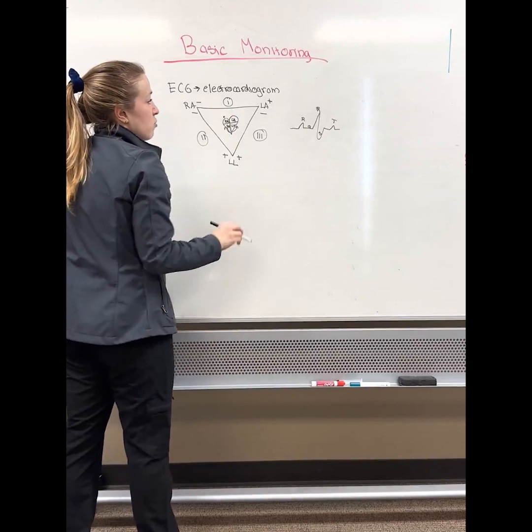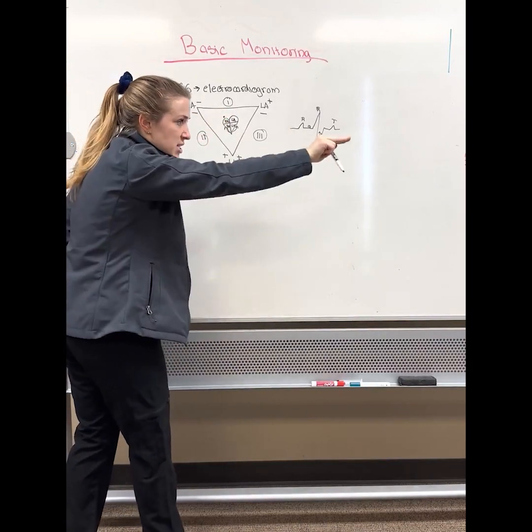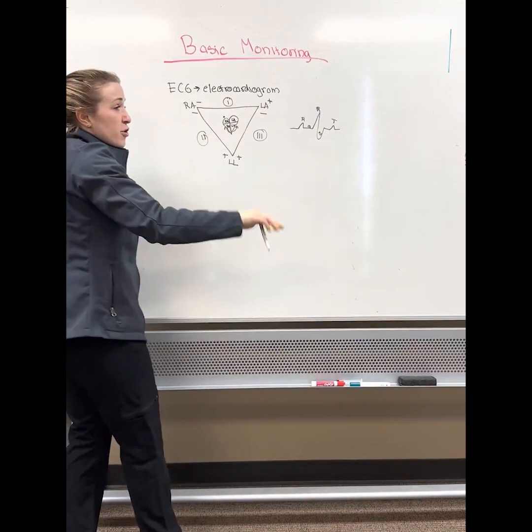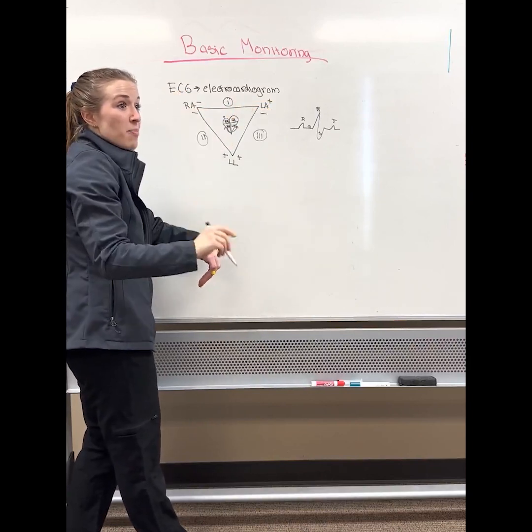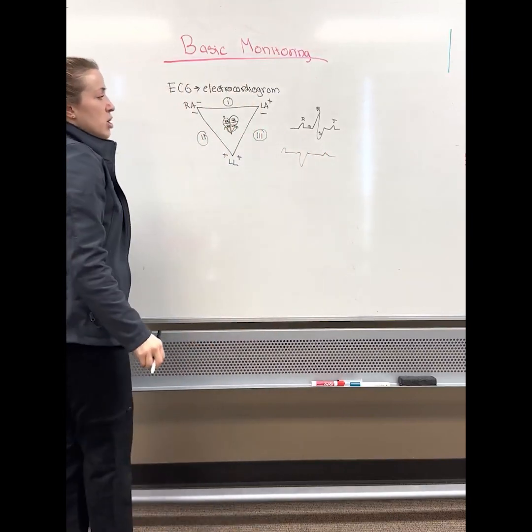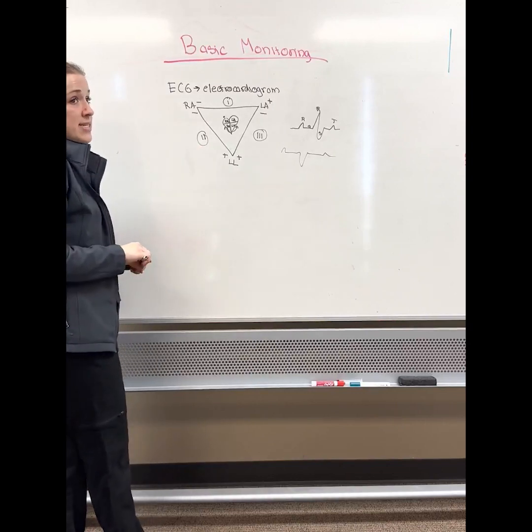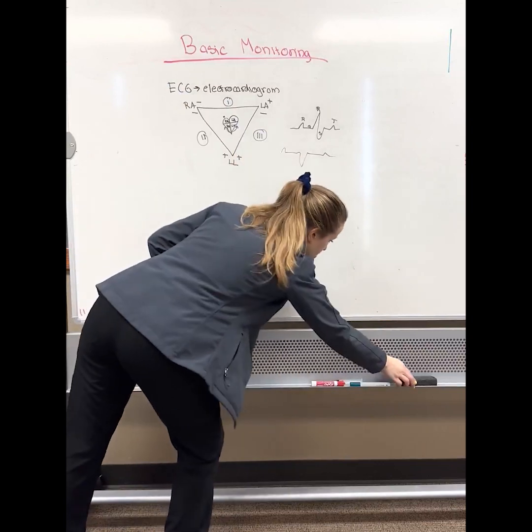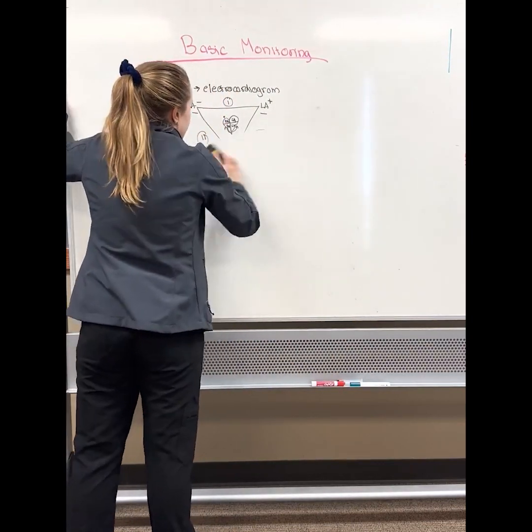Now, if you select lead 1, you're going to look at the electrical activity kind of across this way instead of down. So if you're reading this way and the heart depolarizes this way, is the QRST going to go up? No, it will not. It usually ends up being inverted. So in dogs and cats, we usually end up setting lead 2. In horses and cows, we usually end up setting lead 1, in case you were interested. So that's the ECG. I will erase this diagram for now.